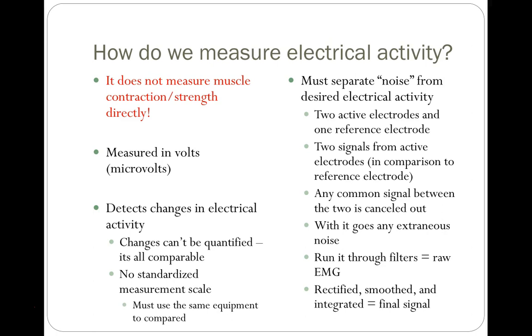Now when you're doing EMG and getting the actual graphical readout, it needs to be filtered. It gets run through filtering to become what's known as a raw EMG, and then it's rectified, smoothed, and integrated for a final signal. You don't have to worry about that unless you get into more advanced biomechanics. If you go to school for exercise physiology, or I did some EMG work for my master's thesis in grad school, you'll use more advanced EMGs and have to know your equations and such to rectify your signal, but we don't have to for our portable units.